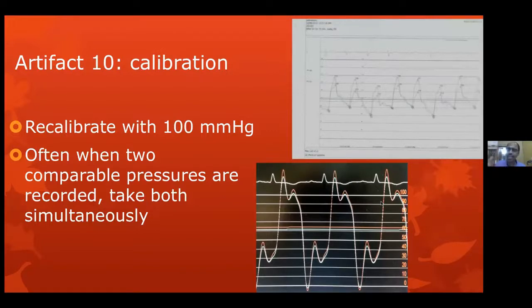This is the standard understanding. Pressure transducers are not meant for negative recordings. There is no calibration below zero for a pressure transducer. So subatmospheric pressure cannot be measured by the fluid-filled transducer system that we practically use in the catheterization laboratory.